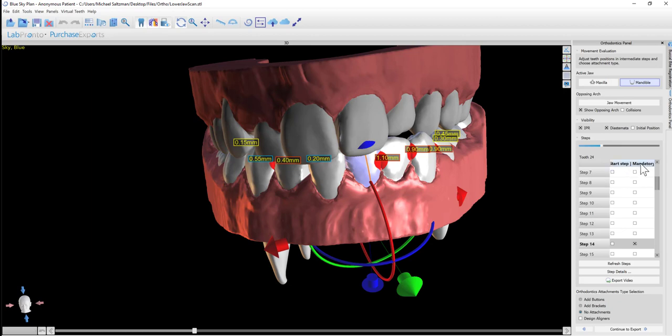Same thing with the mandatory column. If you want to make sure that a tooth is moving at earlier steps, for example, you could check the checkboxes for that tooth in the mandatory column, and the software will recalculate.